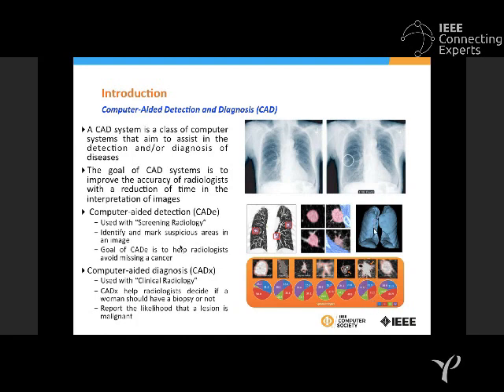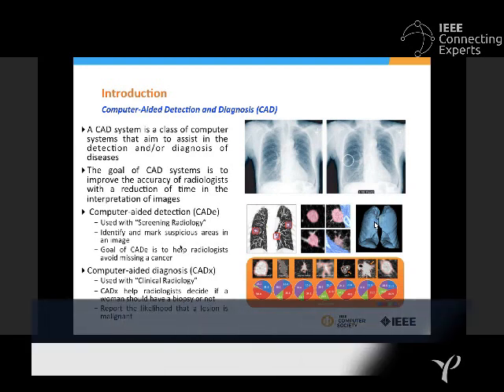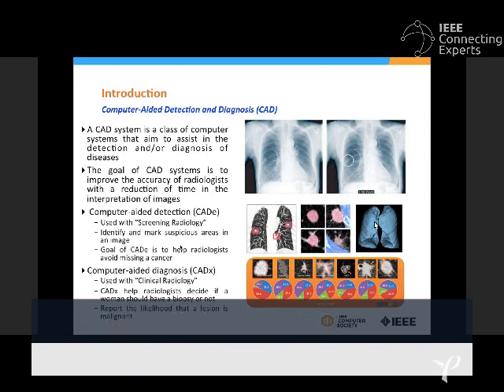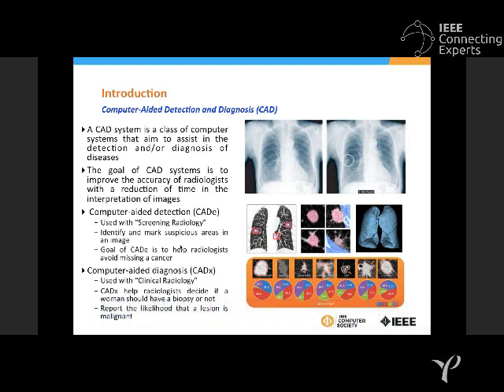In so many of the cases, we know that the doctors look into the image and try to find out what is the best point, or what is the best region of this particular organ to do a biopsy.